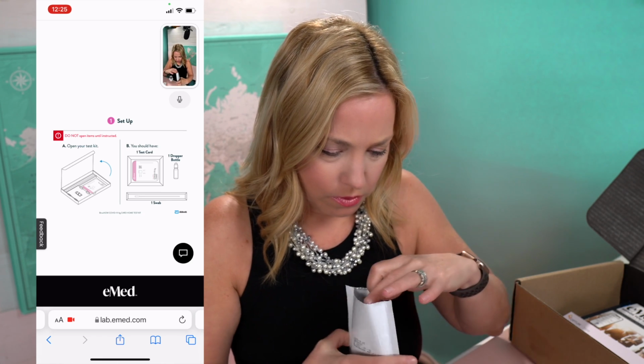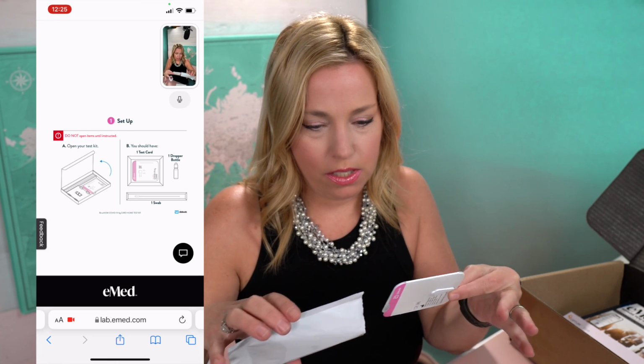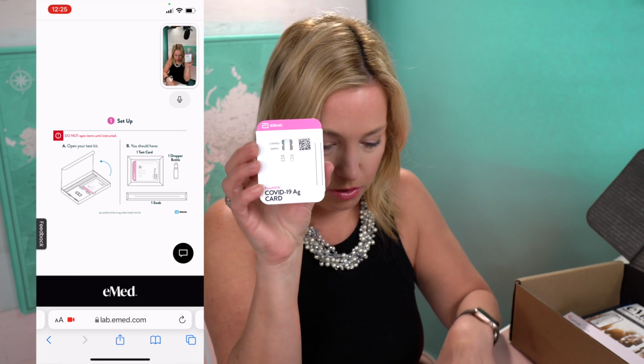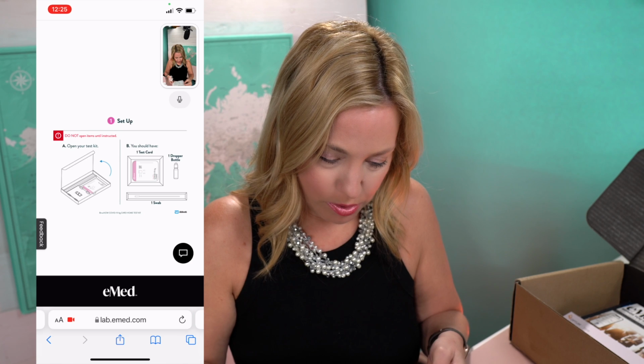Okay. Take out the test card, please. Okay, take out the test. Okay. Now open the test card and lay it completely flat like an open book. Okay, open the test card and lay it flat like an open book.